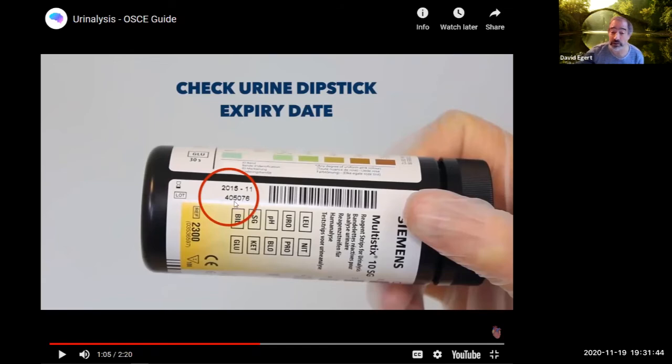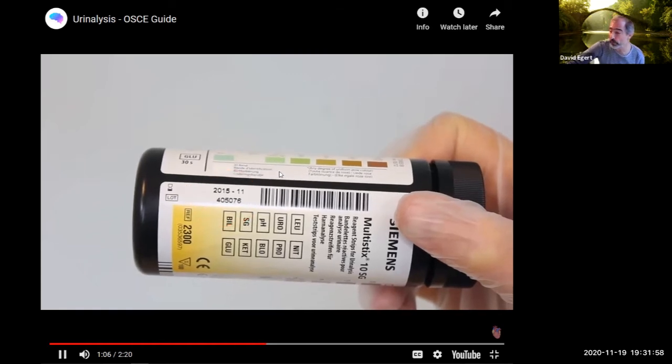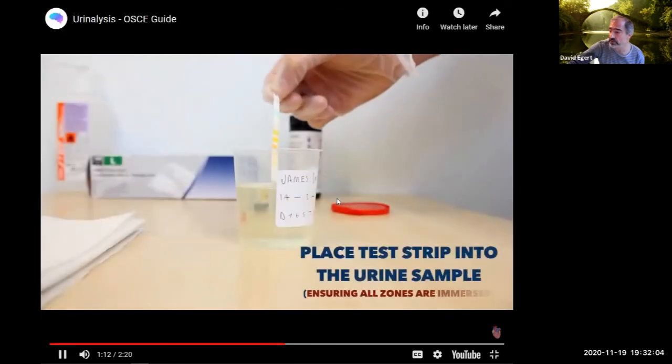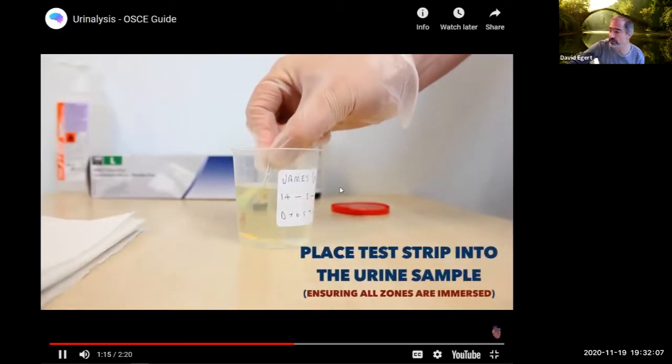So this is actually important. When these things get old, they start turning colors without anything and they don't work properly. So we end up throwing these out every once in a while because we realize they've started going bad on their own. And again, this was a clean catch. James here started peeing and then put the little cup under the stream once the flow had started. So the initial peeing flushed out and hopefully cleaned things out.